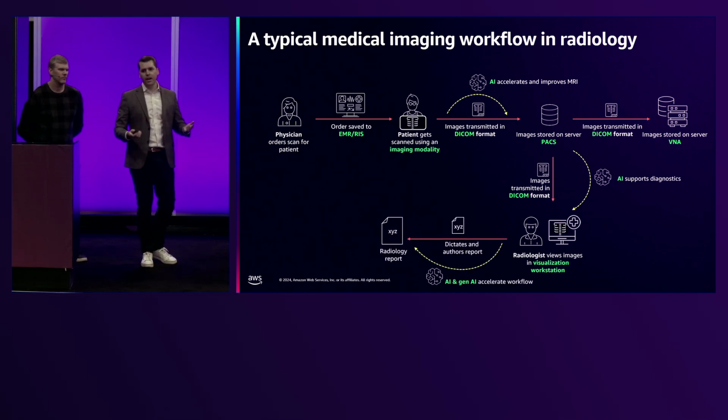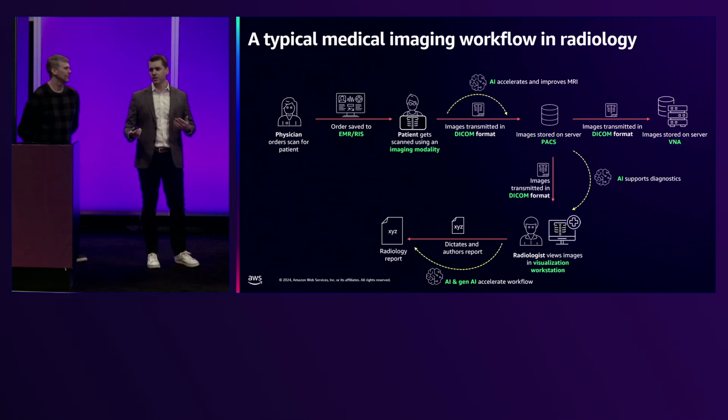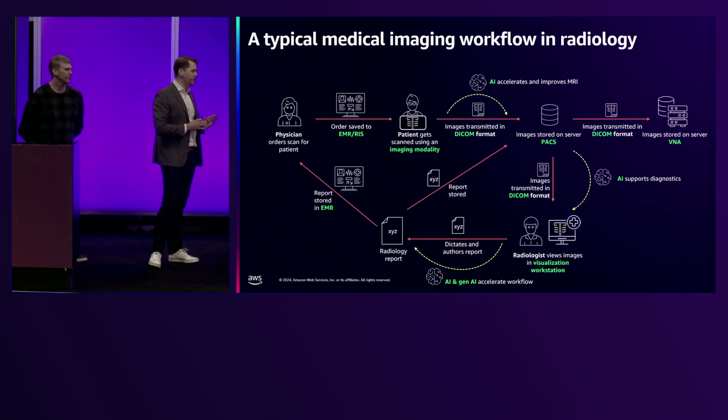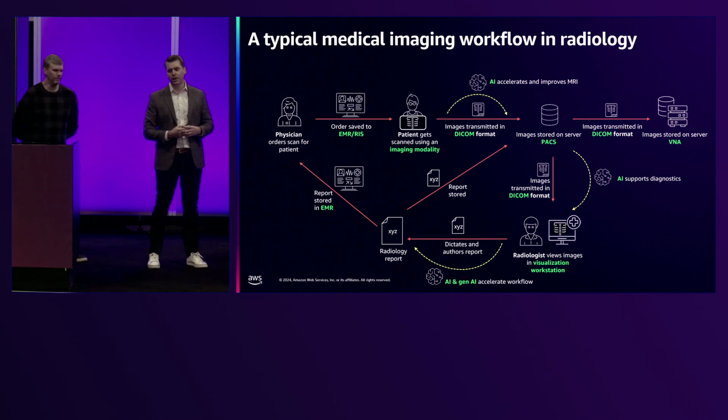And after all of that, they need to create a summary of what their findings are, right? And when they're doing these impressions, they want to look at, okay, what's the differential diagnosis? What are the leading indicators of what they're finding in their imaging that is actually going to impact downstream patient care? Once those reports are finished, they get pushed out to either the PACS system or the respective electronic medical record platform.